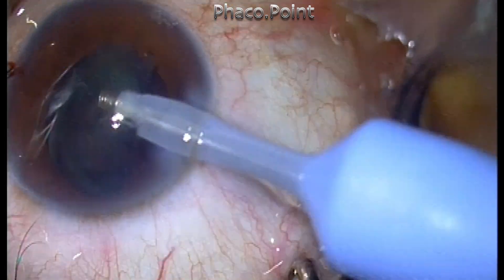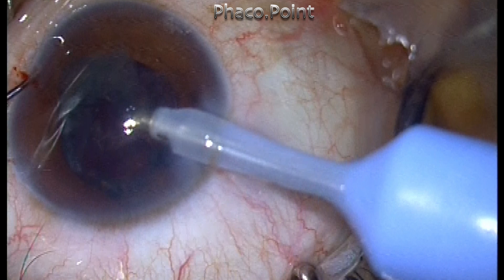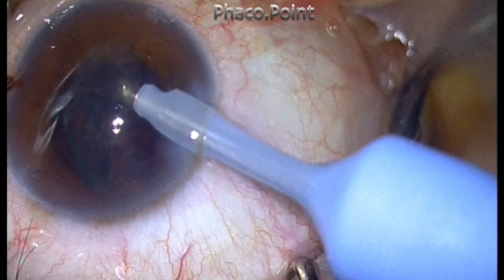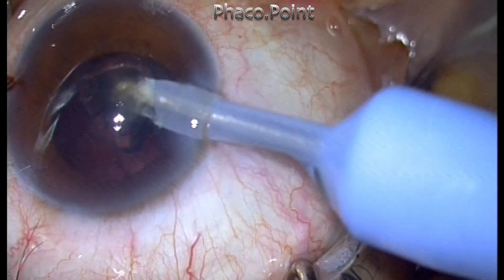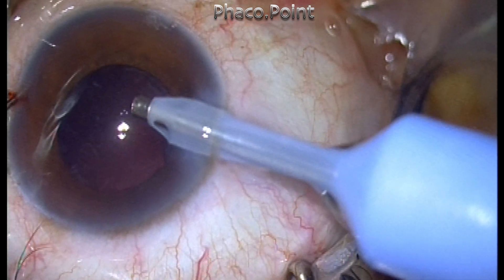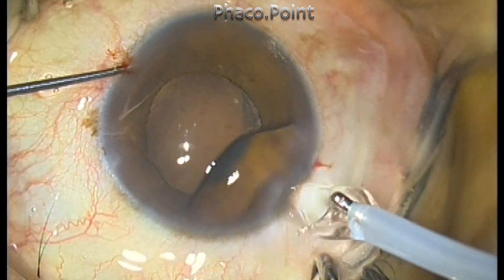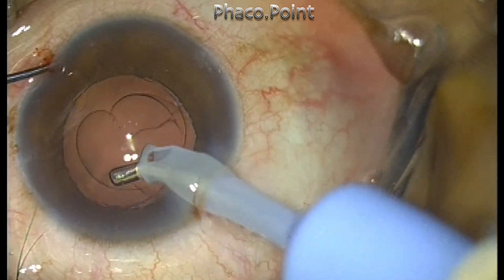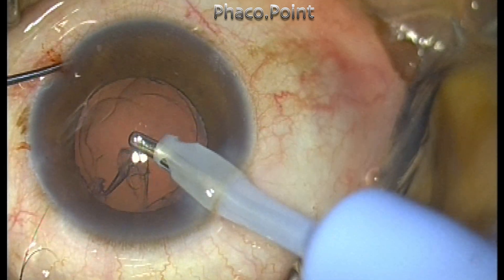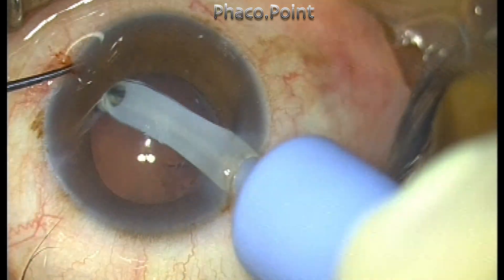For the epinucleus, I'm just using the epinucleus mode settings. Actually, it is not very difficult to perform one-handed phaco. Of course, you have to create the fragments first, for which a bimanual technique is needed. The cortical aspiration is also being performed just using a single hand — my dominant hand only. The coaxial IA probe can remove the cortex quite easily as long as the eyeball is stabilized from outside.